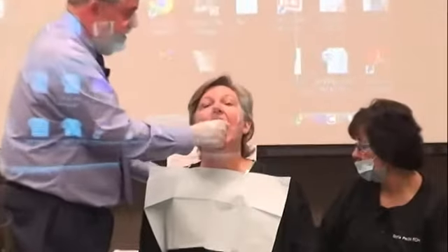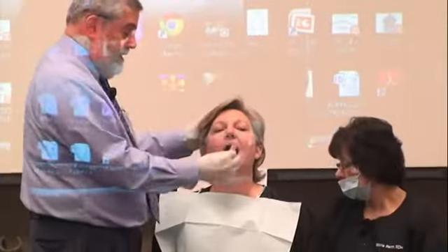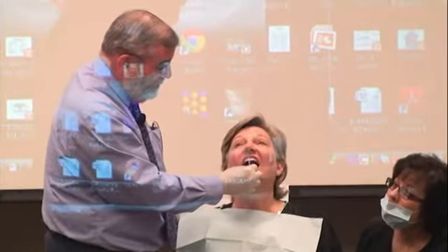We're going to look and see if there's a little bit of tongue tie. We use these little wafers — in this case from Great Lakes Orthodontics. Open as wide as you can — 54 millimeters opening. Now put your tongue in the roof of your mouth and open. Leave your tongue there, as flat as you can in the roof of your mouth. How wide can you open? About 28 millimeters. So if you've got that two-to-one ratio — if it's less than two-to-one, the chances are good that there's tongue tie, whether you see it or not.